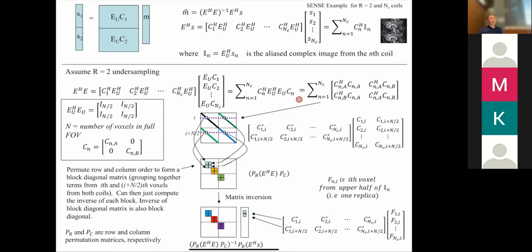And basically, that's why GPUs work really well, right? Because essentially, GPUs are really good at solving lots of small problems individually, right? So SENSE is essentially a way of doing that, where, for example, that's why SENSE works really well if you have a GPU, because you basically can solve all these individual problems simultaneously. Okay.